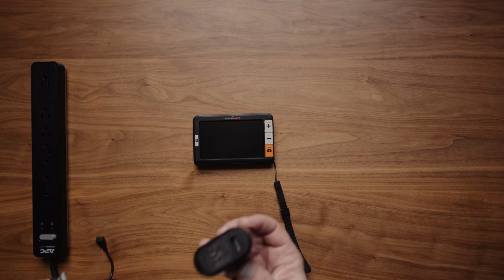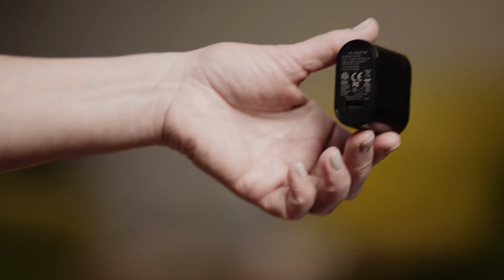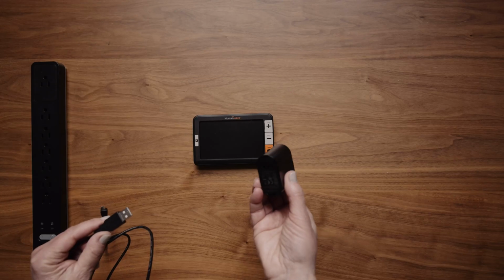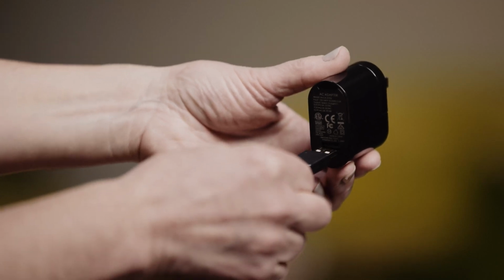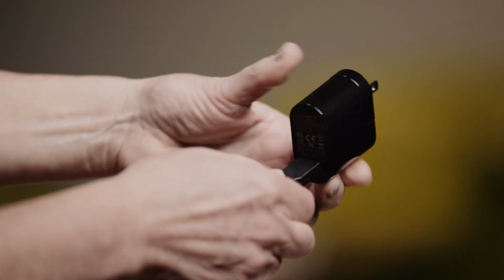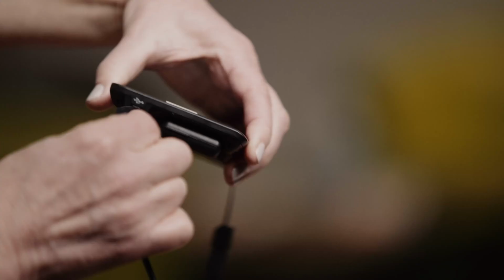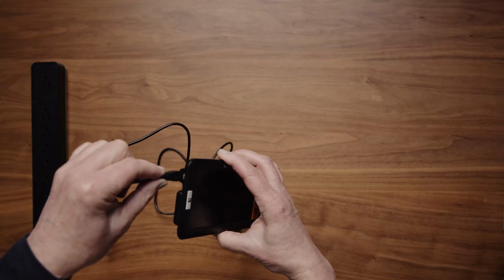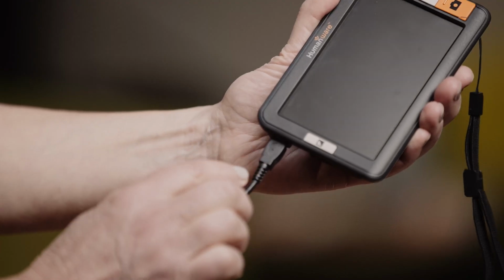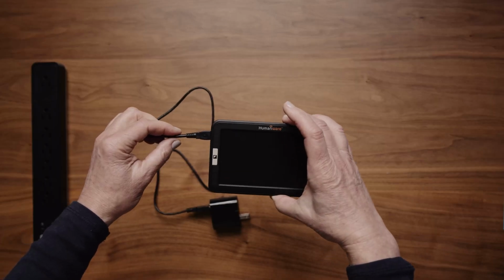Charging the Explore 5. 1. Find the power adapter, power brick. 2. Insert the larger side of the USB cable into the power adapter. 3. Insert the smaller side of the USB cable, the micro USB connector, into the Explore 5 power port. The single bump on the connector must face up.